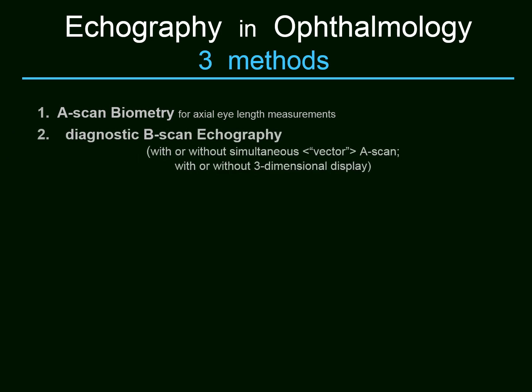Then there was diagnostic B-scan echography with or without simultaneous vector A-scan. We will talk about this in chapter 11 of the introduction. Or with or without three-dimensional display.